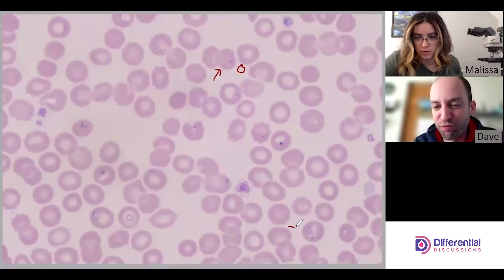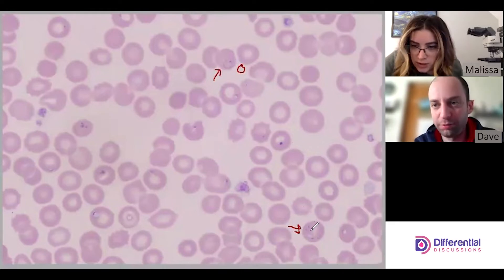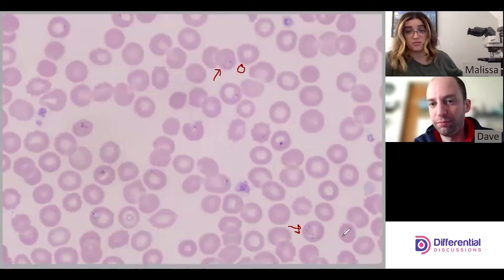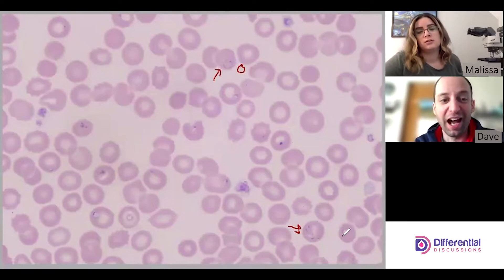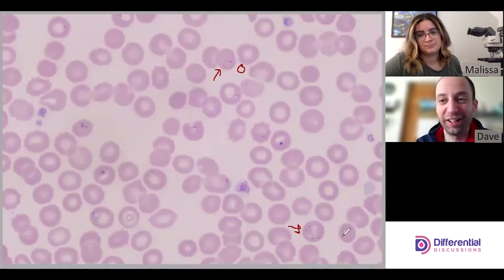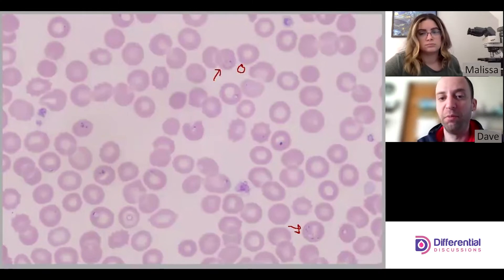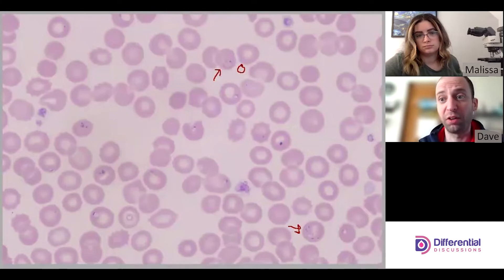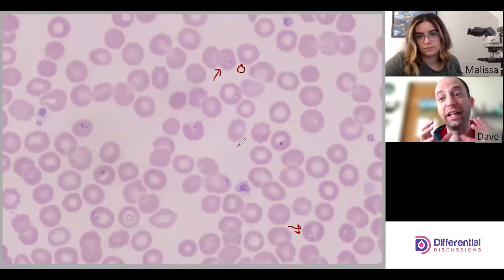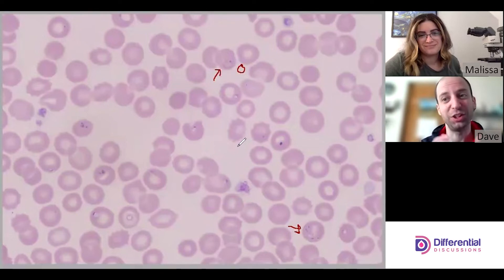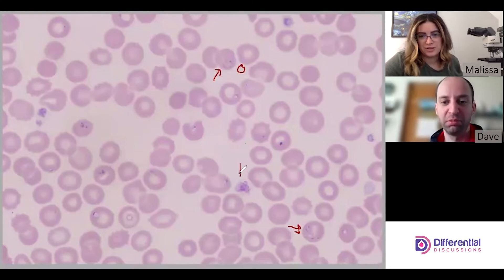Like when we talked about Plasmodium falciparum, Babesia also has multiply infected cells. Here you can see there's a ring here, here, and this one's got three in it. Another thing that tips you off for Babesia: with Plasmodium, organisms are inside the red cells strictly, but with Babesia they can be floating around in the peripheral blood. There was a situation where a clump of Babesia organisms at a quick glance could be mistaken for platelets.